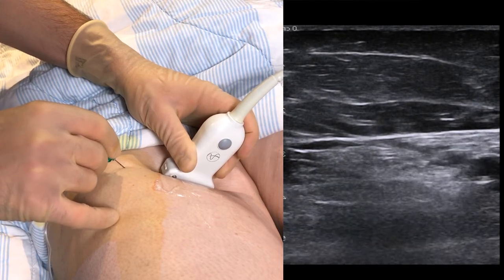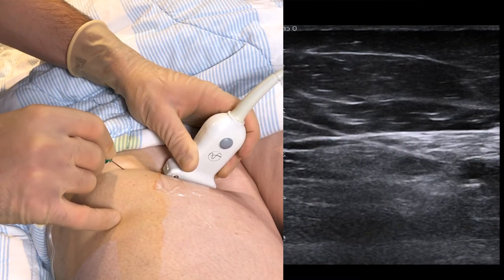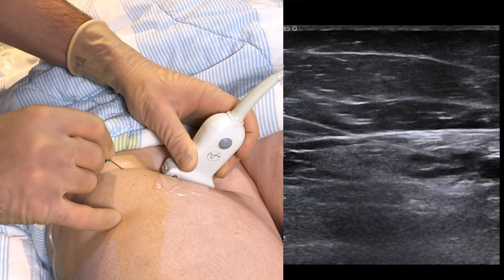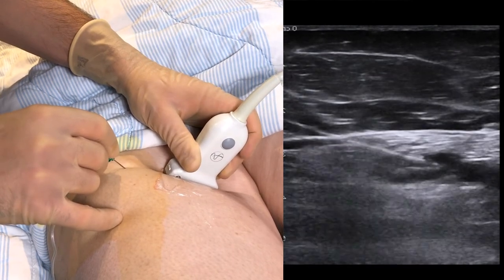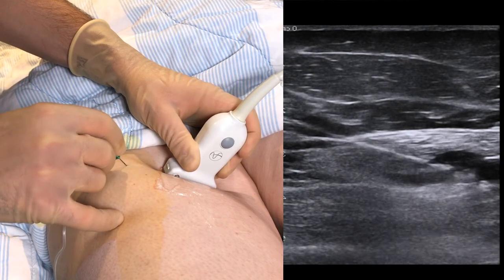Start injecting just lateral to the artery. The goal is to completely surround it in order to accommodate anatomical variations. We find that a volume of 5 ml on each side of the artery is usually sufficient to achieve a good block.